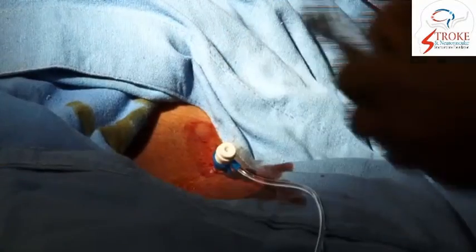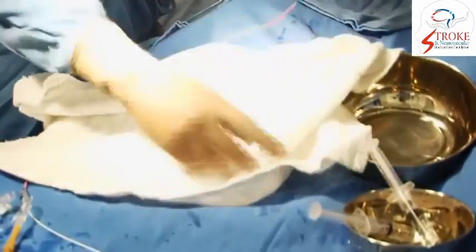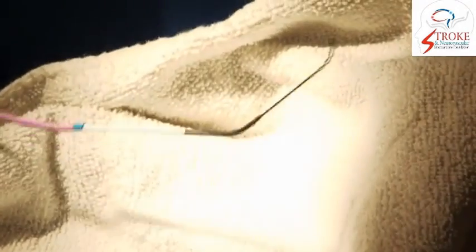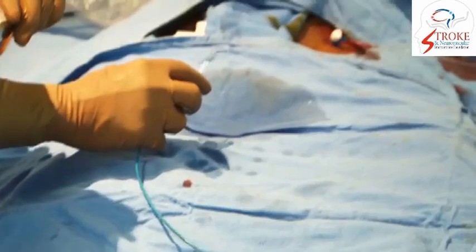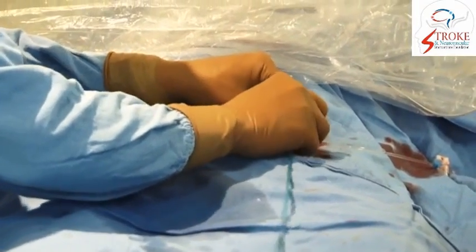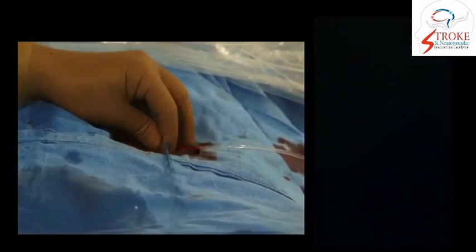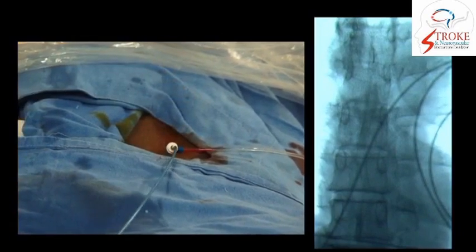For the guide catheter placement, we always prefer a coaxial system, so a soft tip 5F catheter is being used along with the 8F guiding catheter. We think it improves the safety and the ease of placing the guiding catheter. Fluoroscopy is always used for manipulation in the thoracic aorta and the arch of aorta.